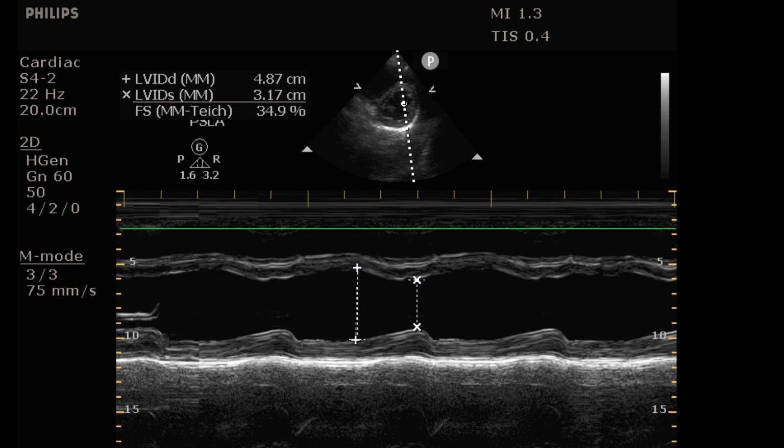So this brings us to the question then, how do we interpret the fractional shortening? Okay, so fine, I got two numbers. What do I do with these things? What's the formula you keep telling me about? And how do I make decisions off that?